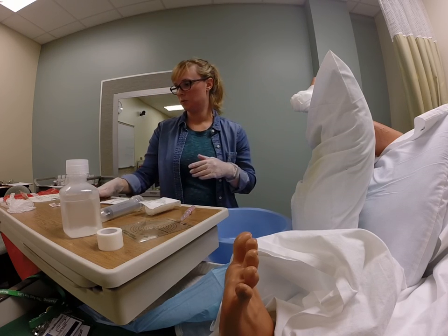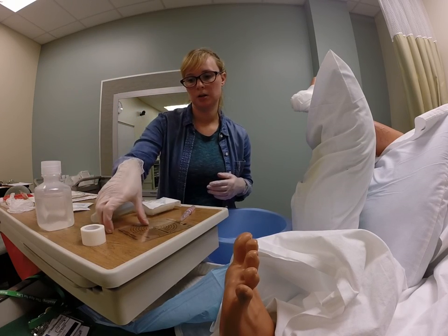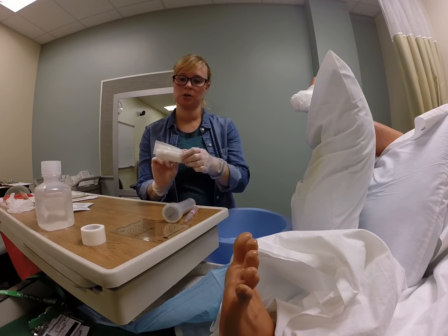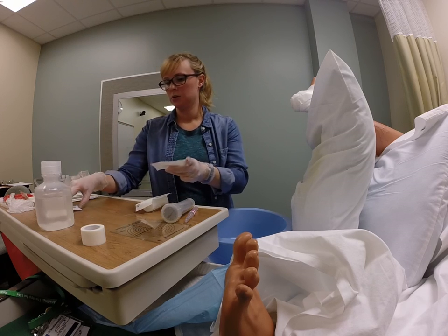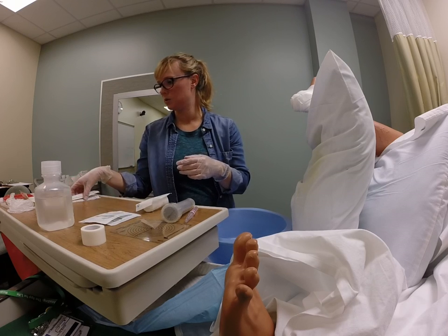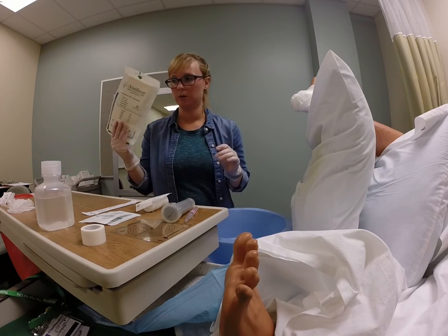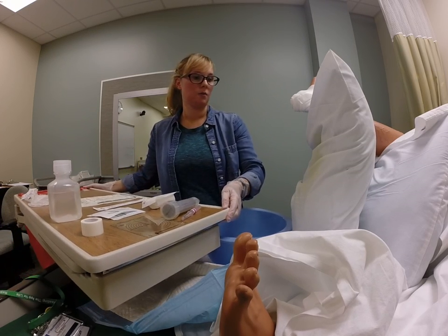Clean gloves to remove the old dressing. First, some supplies. So my sterile water, tape, measuring device, my angiocath, 35 ml syringe, my conforming gauze is what I call it, or gauze roll, 2 packages of the 2x2 gauze, and there's 2 in each of those. And I only need 1 package of my cotton tip applicators, 2 pair of clean gloves, and 1 pair of sterile gloves.